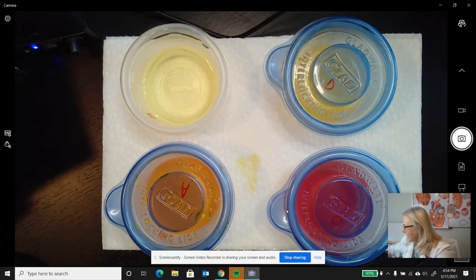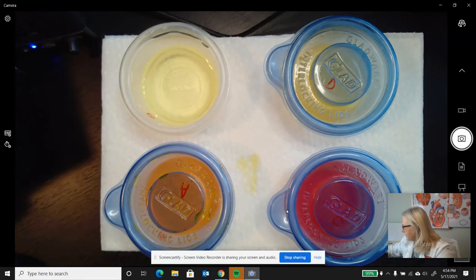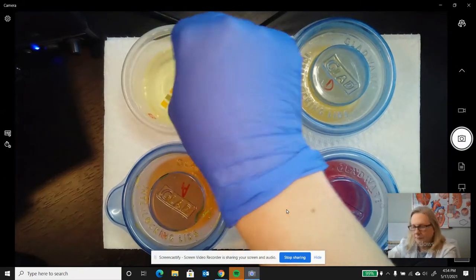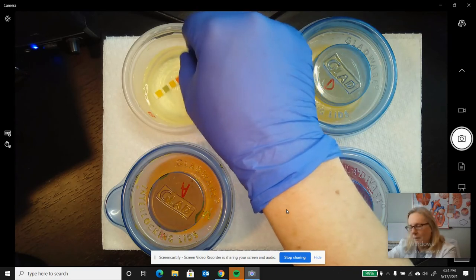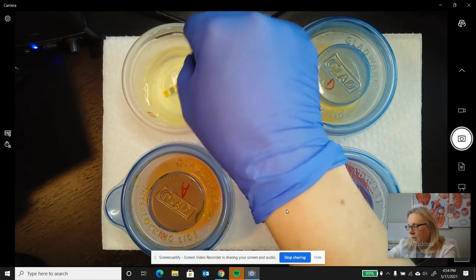All right, let's go ahead and check the pH. Oops, this one's been used. I apologize. Let's check the pH of this lovely young athlete. Here comes my pH strip. Again, I need about 30 seconds with it in there. You can see it's turning a little bit wet. It turns a little bit of color almost immediately, but not too quickly.